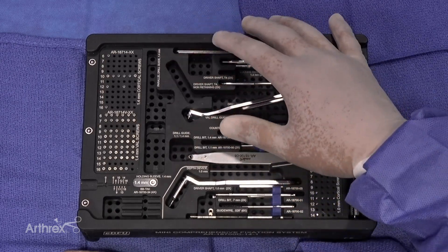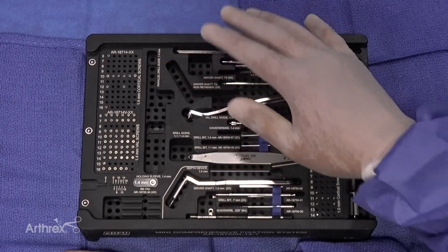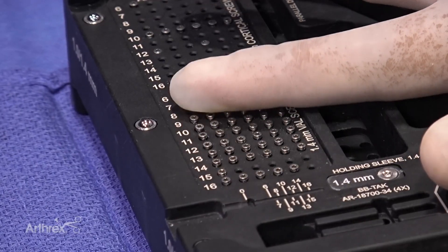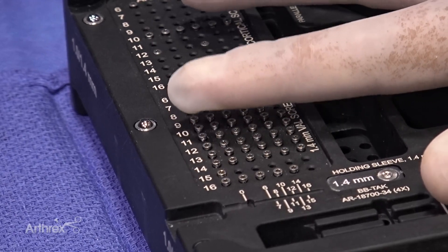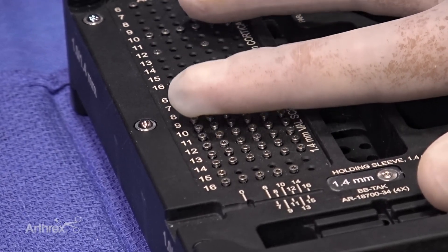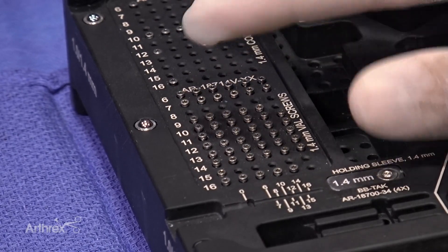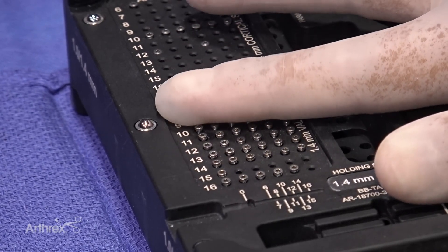I want to show the actual screw set. If you put your fingers over the tops of the screws and feel that they're all level, this is what we call stadium seating. Only the screw that fits that particular hole will actually be able to fit nicely in that slot.